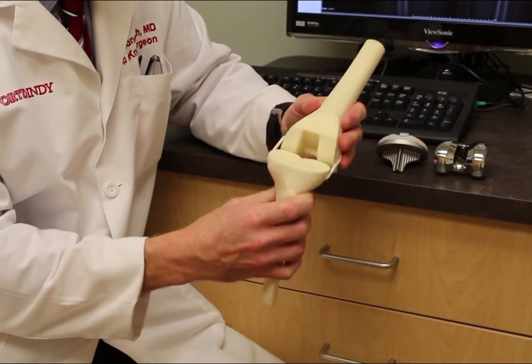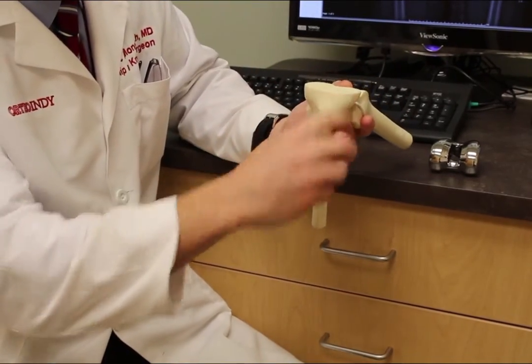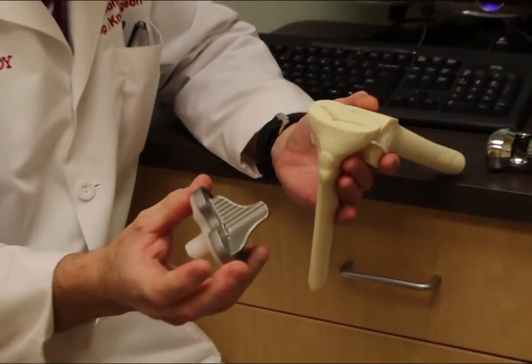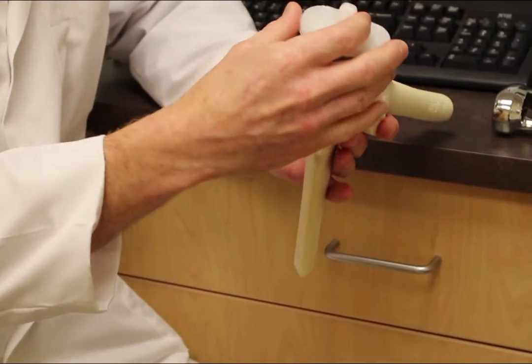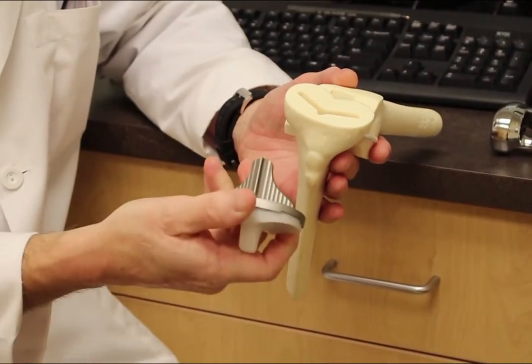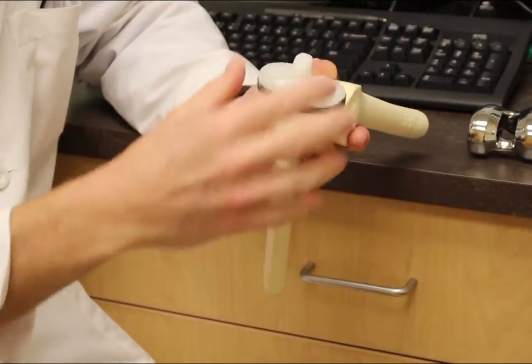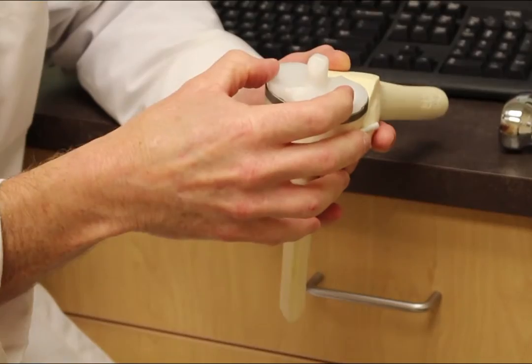On the top of the shin bone, we make a simple T-cut, and then there's a metal tray that goes down onto this new cut. There's a little keel on the bottom of the tray that goes down into the bone, and a piece of plastic that snaps in there.